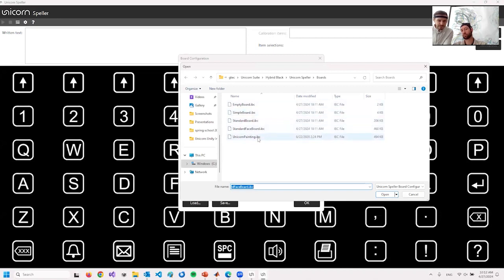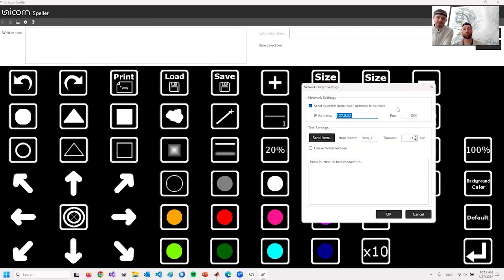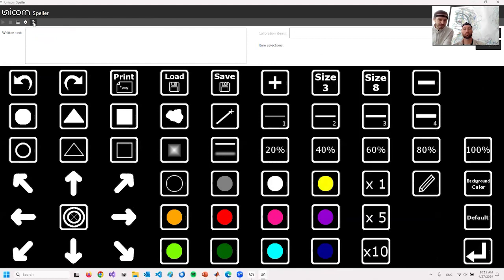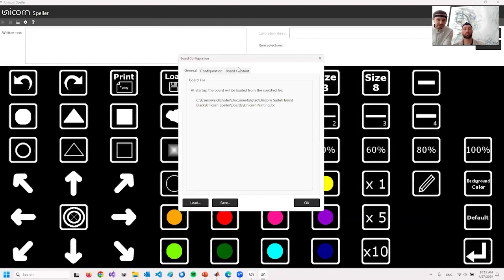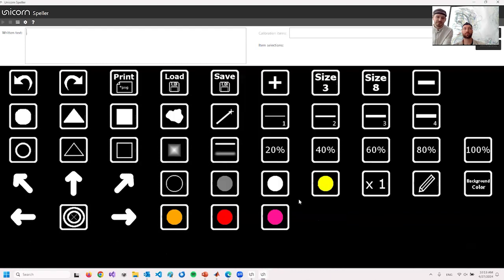We have a demo for this here because we also have a painting application. And now you could select one of these items for your application. And you can configure the network output for each of these items in the board and timing section. We have each item, the image, the dark image, the name, and all this information is sent via network. So whenever something is selected, you could receive that in your application and control something.